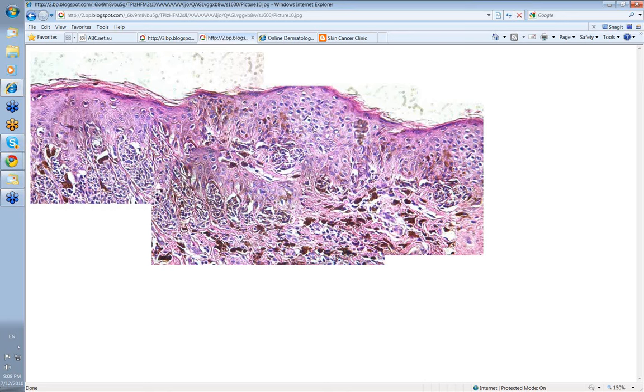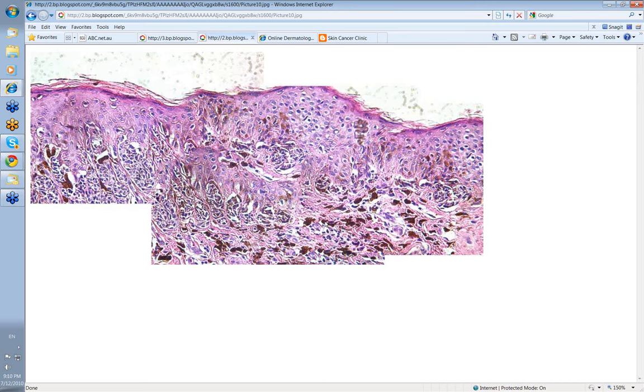They didn't look angular like the cells down at the junction there, and so I really had no idea. There was certainly a lot of melanin down here—the melanophages down in the dermis as well. Well, David's report was that he wanted to call the lesion benign. He said it has some of the features of a Reed nevus with heavy melanin incontinence, which is what we're looking at down here.